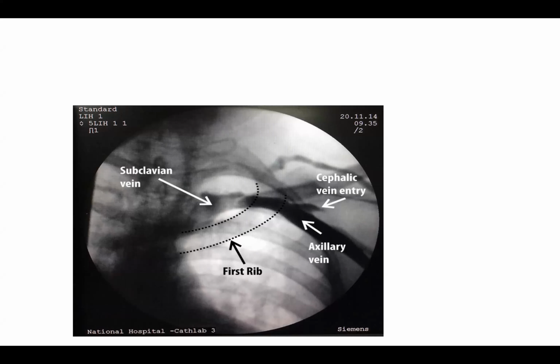You don't need to look for a coronary sinus. Then just take your guide and look for where the posterolateral vein is and implant. It is very simple. But if you are doing a pacemaker, and you want to enter into the RV, you may have some little challenge.